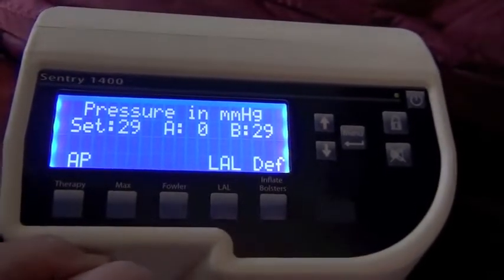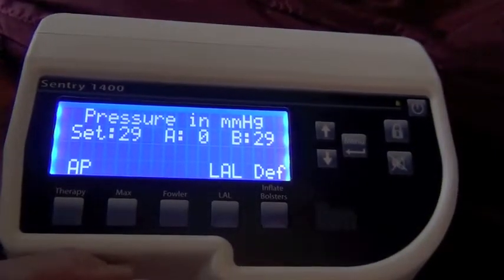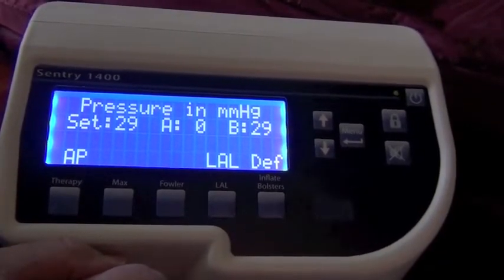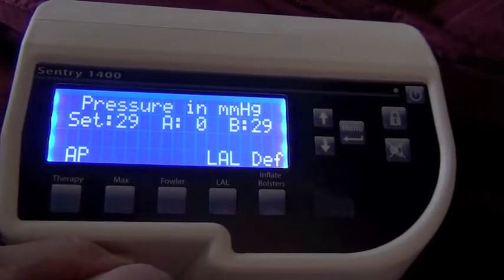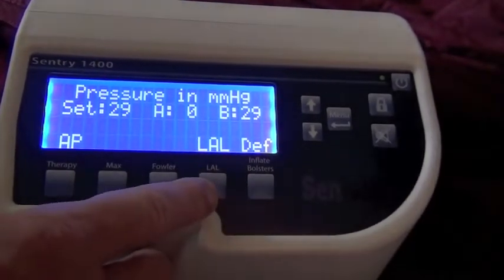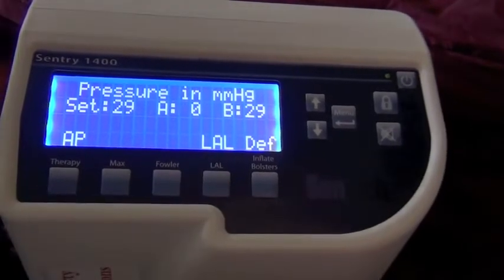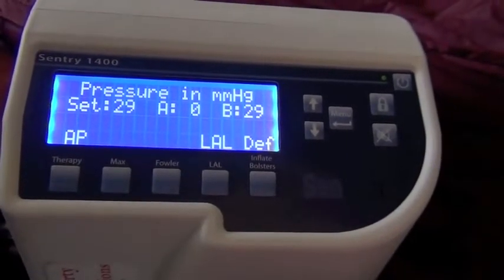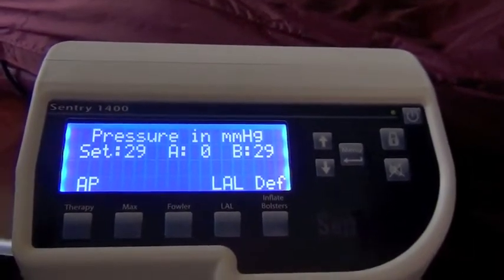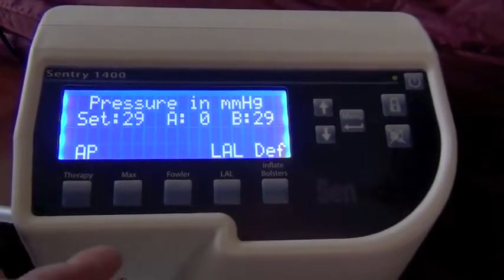What it does is it very aggressively evaporates moisture coming through the patient's skin. And I'm going to show you in a moment some characteristics of the material that will help to show you that feature a little better. Anyway, low air loss can be, again, turned on and turned off at your discretion. I think it's pretty harmless, actually. It manages microclimate. However, and microclimate would be humidity, temperature, moisture level of the skin. That's the intent of it.